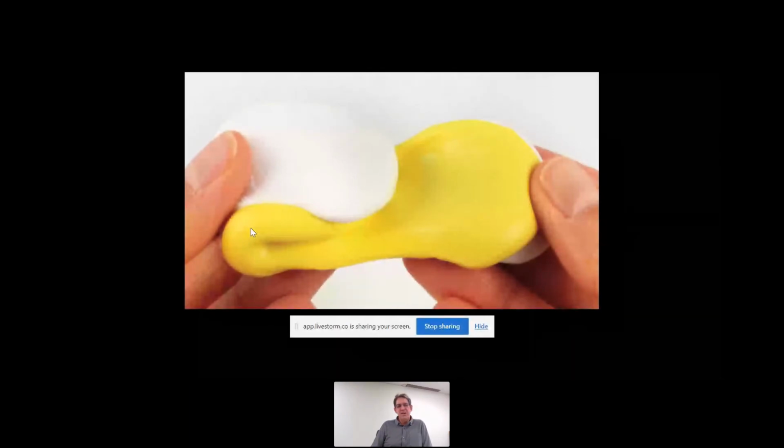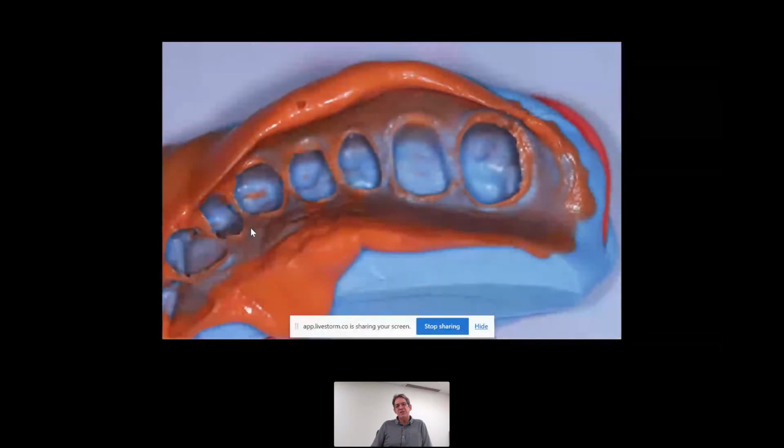And sulfur contamination is one of the reasons why materials don't set completely. And then the other challenge with putty is they are so filler dependent that they tend to over displace the wash material. So you can see here in this impression, the orange material is the wash material, and it's been completely over displaced out of that preparation site.